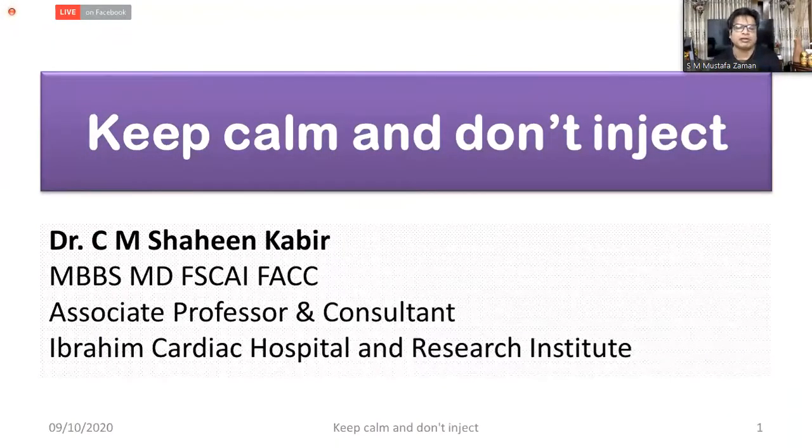I have shared this type of information in a previous BSCI seminar. The term is new, but the whole world was doing this type of work before, especially in our BSMMU with a lot of kidney patients, where we use a little amount of dye during engagement of the left main. Though this term is new, this is a technique everybody should practice as an approach.